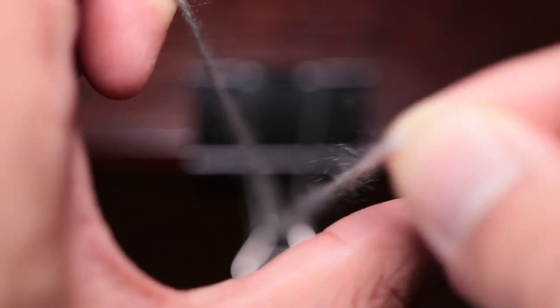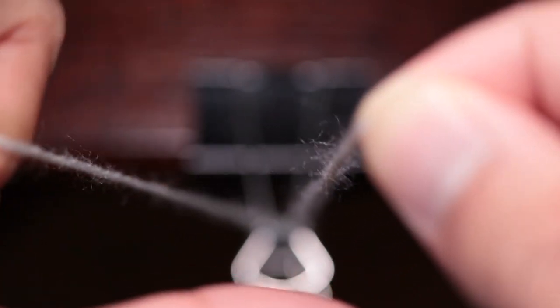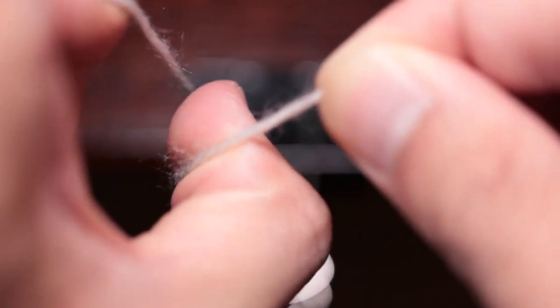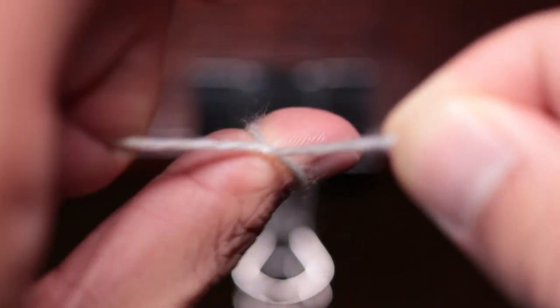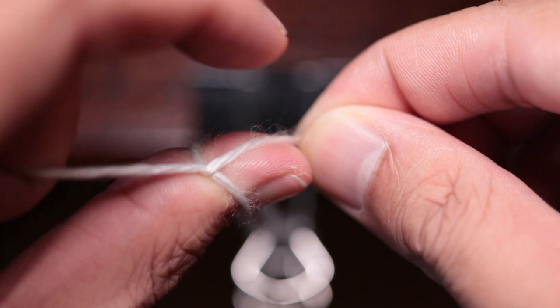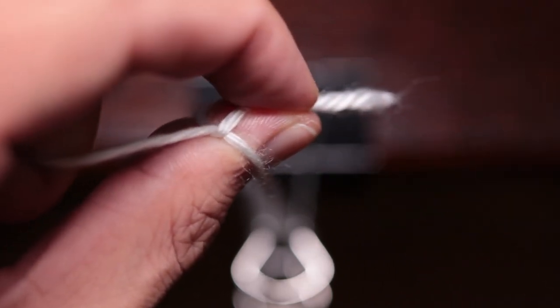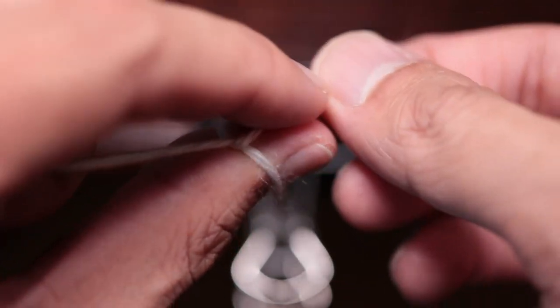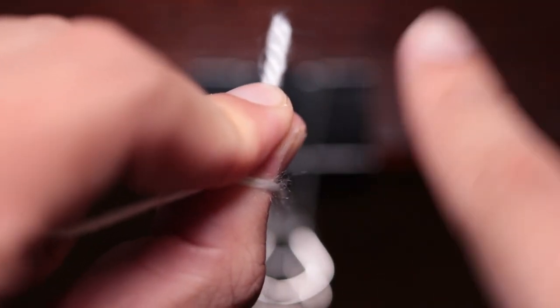The thumb side is the same idea—free end first with your thumb. You're grabbing that free end toward your left hand, going under the other string, putting the free end on the thumb, clipping it between the index and thumb, making sure to only grab the free end and not the crossings of the string.